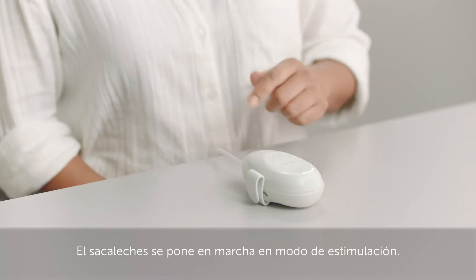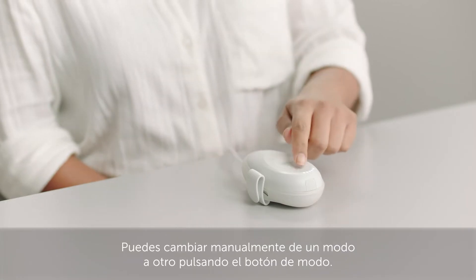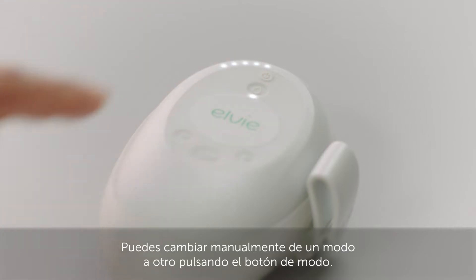Your pump starts in stimulation mode. The pump automatically switches to expression mode after 2 minutes. You can manually switch between modes by pressing the mode button.